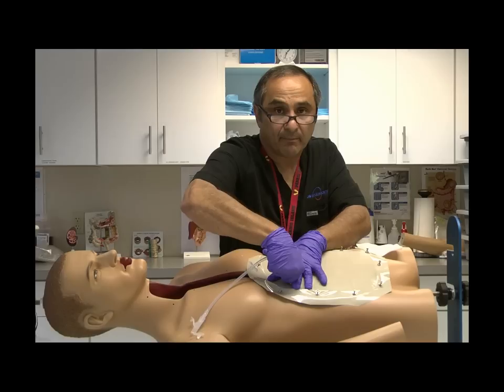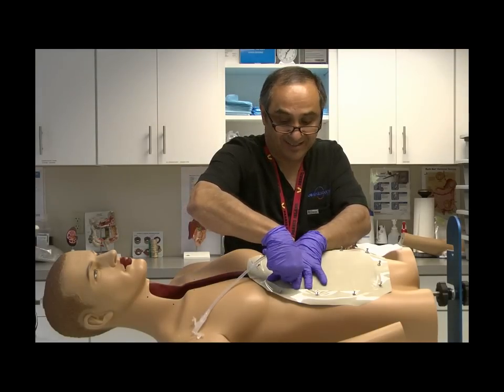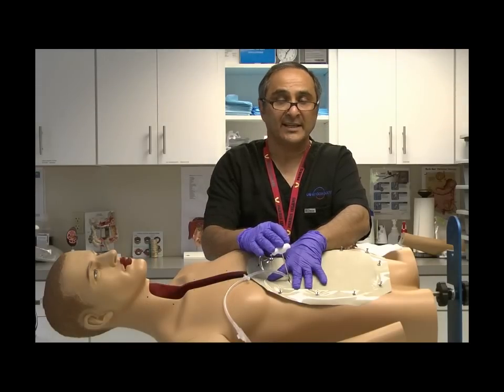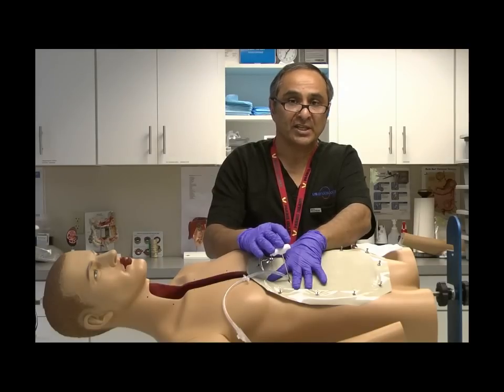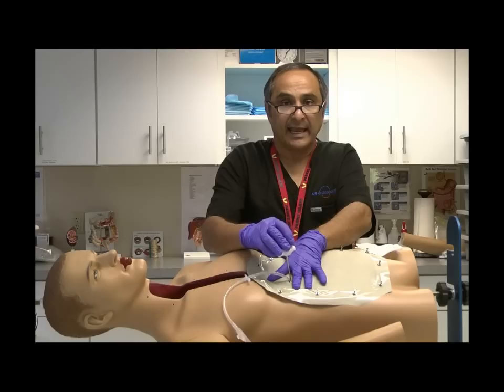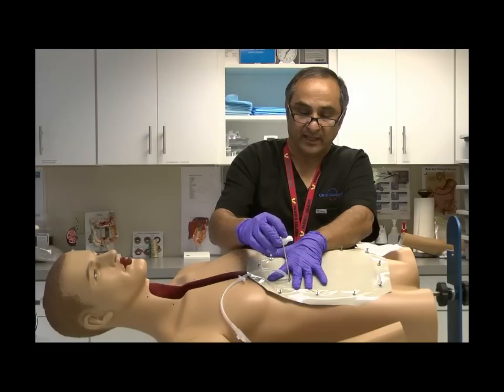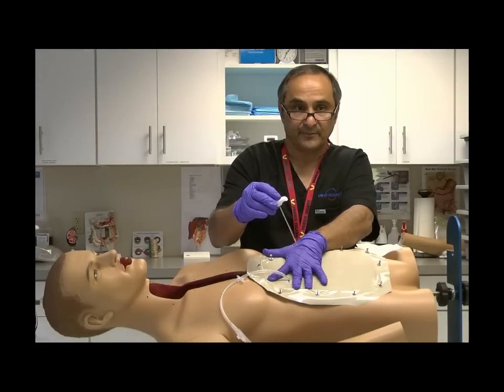You'll feel it pop. At that point, I keep the obturator held in place and release the tension that I placed on the non-balloon replacement. By releasing the pressure on the non-balloon device, the mushroom returns to that round circular position, and then I know it's secure inside the stomach. At this point, I remove the obturator, again leaving my fingers here to support the tissue.